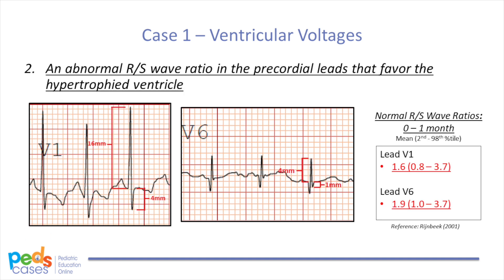The next major finding we look for in ventricular hypertrophy is an abnormal R-to-S wave ratio in the precordial leads that favor the hypertrophied ventricle. You measure the R and S-waves typically in V1 and V6, then divide the R-wave by the S-wave to get a ratio. Based on the Rinbeek tables, the normal R-to-S wave ratio from 0 to 1 month in V1 is 0.8 to 3.7, and 1.0 to 3.7 in V6. In our patient, the R-to-S wave ratio in both leads V1 and V6 is 4, which is slightly above the upper limit of normal for age in both leads. This finding does not fulfill criteria for ventricular hypertrophy, however, as the ratios do not favor a specific ventricle. The R-to-S wave ratios are slightly high in both the right and left-sided leads and are therefore nonspecific to either ventricle.